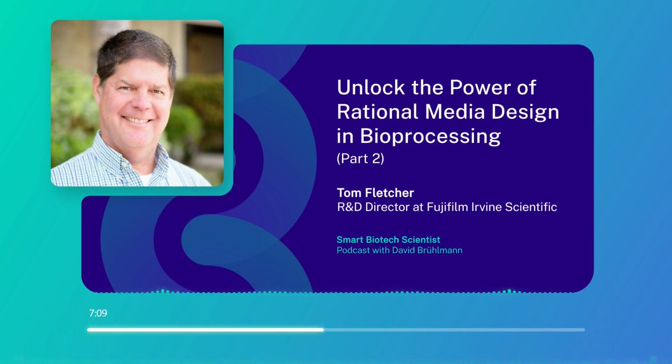Yeah, smart scientists, rational media design has great potential. And it's not only in the genetics or the finding the right cell line. It's really also about changing the environment. And I found also in my career that just by changing some media components, you can boost productivity. You can slow down, for instance, cell growth, as you said, in perfusion, or you can change the quality attributes. So use that toolbox. It's an amazing toolbox.